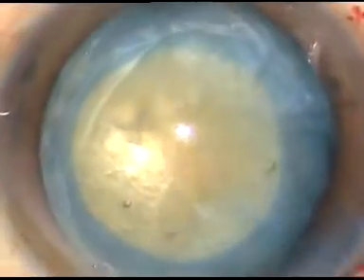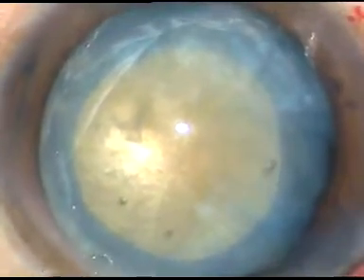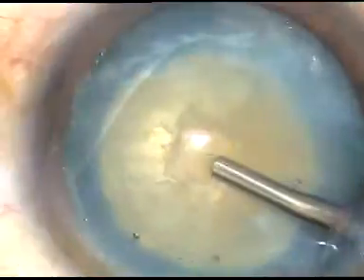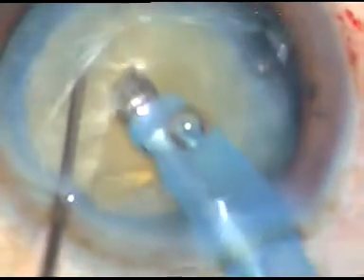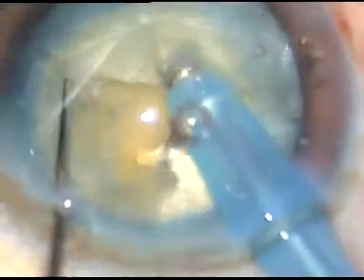That's it. Now in this case, I am going to do a direct chop. This can be called the woodcutter's technique, as described by Dr. Vikas Mahatme. And now I am going to chop the nucleus into several fragments. The nucleus has been divided into four parts.